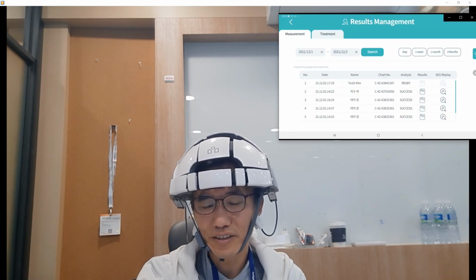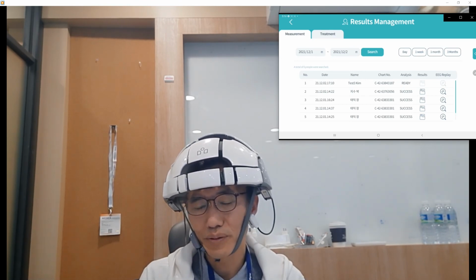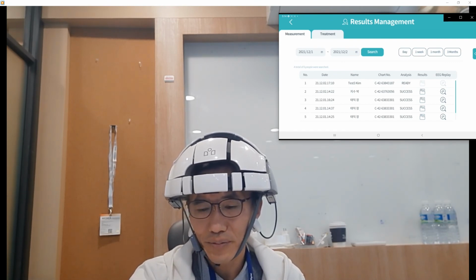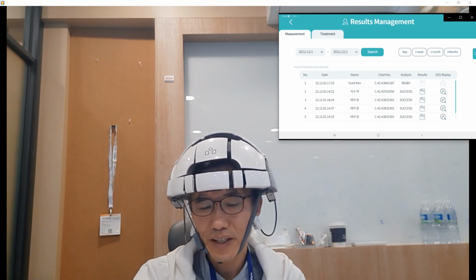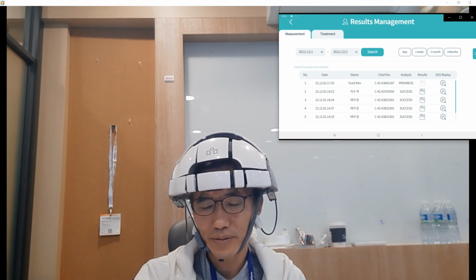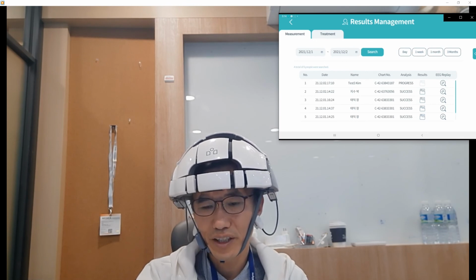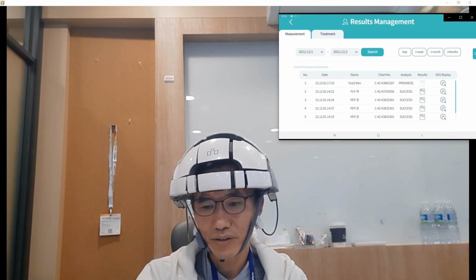This is the short instruction guide, and you can take advantage of this simple iSyncWave EEG recording process. I'd like to add to the YouTube playlist as many guide videos as possible for easy use of the iSyncWave EEG recording, and also I'd like to explain all the results.